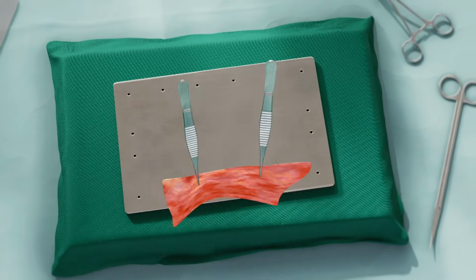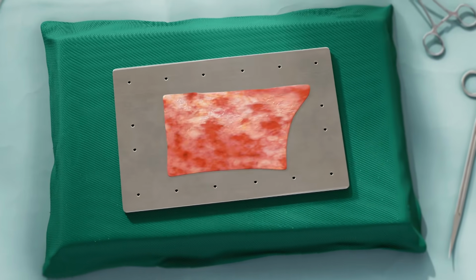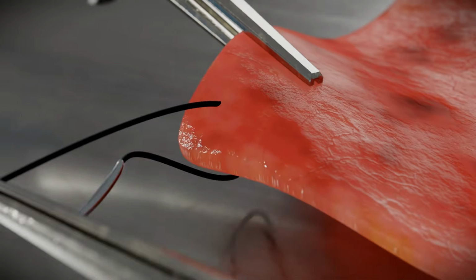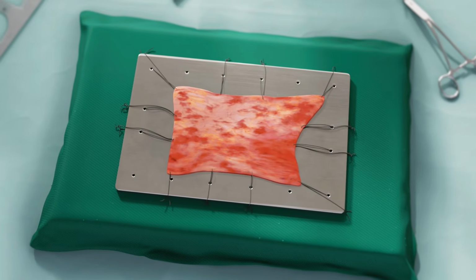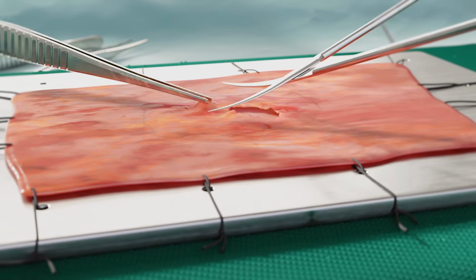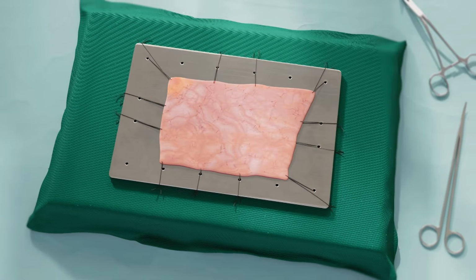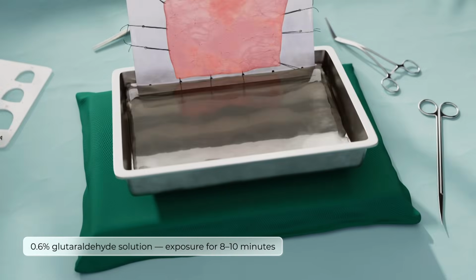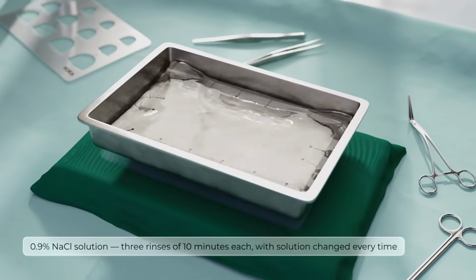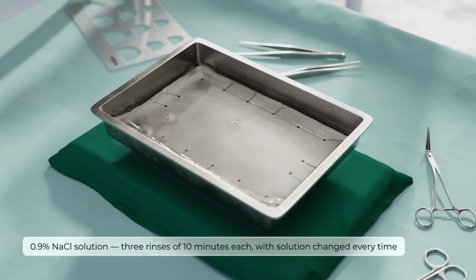The harvested pericardial patch is placed on a special board. There, it is carefully secured and evenly stretched to create a smooth, fold-free surface, then gently cleaned of excess adipose and connective tissue. The fixed and clean pericardium is placed in a glutaraldehyde solution for 8 to 10 minutes and then rinsed 3 times in normal saline for 10 minutes each.